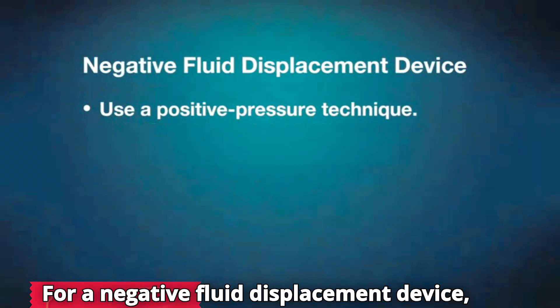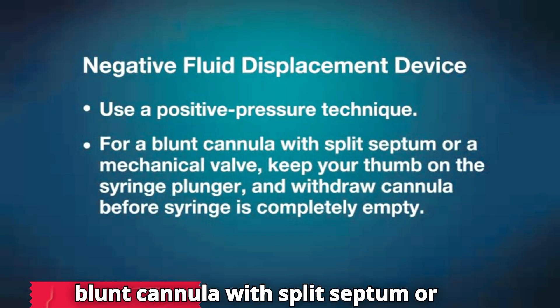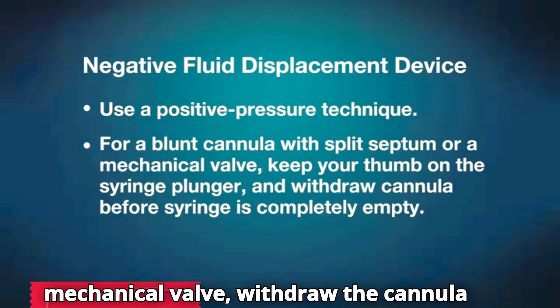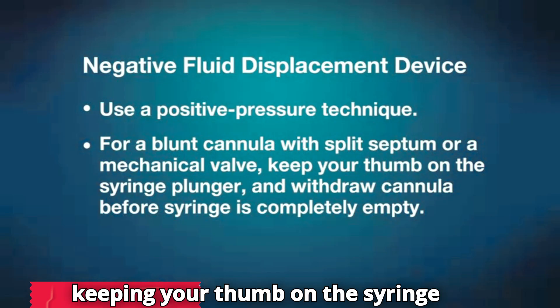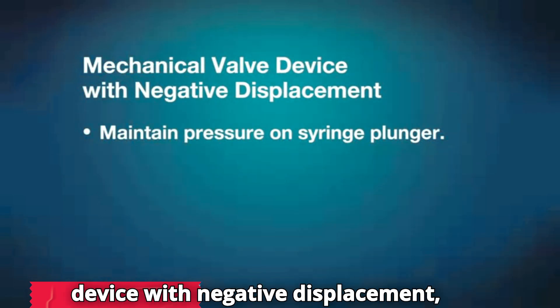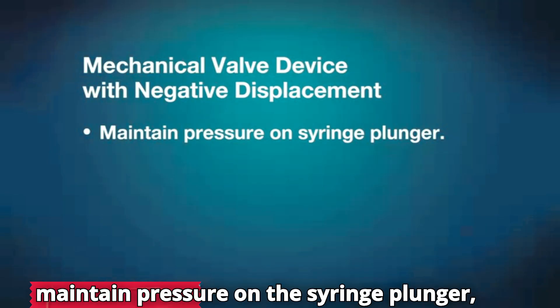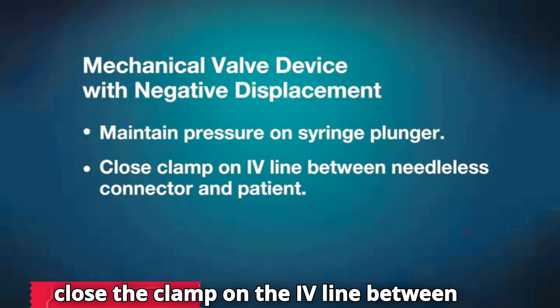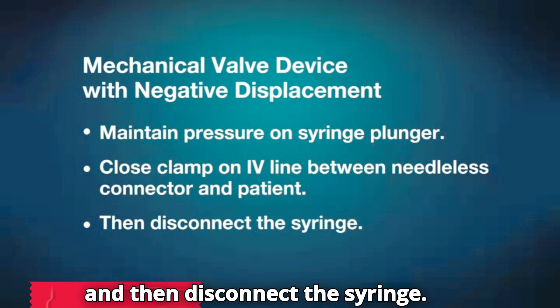For a negative fluid displacement device, use a positive pressure technique. For a blunt cannula with split septum or mechanical valve, withdraw the cannula before the syringe is completely empty, keeping your thumb on the syringe plunger. For a mechanical valve device with negative displacement, maintain pressure on the syringe plunger. Close the clamp on the IV line between the needleless connector and the patient and then disconnect the syringe.